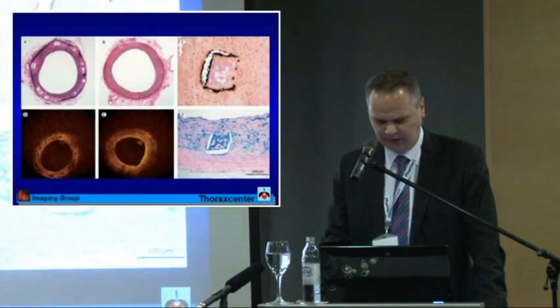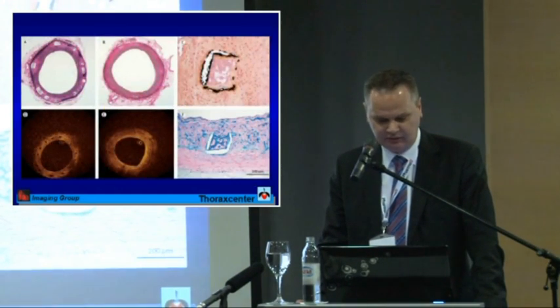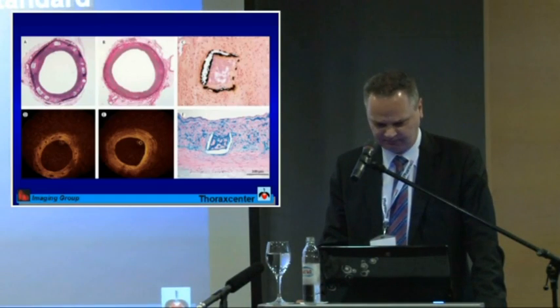And if you look at an implanted stent, you can see here a histology section of a bioabsorbable stent. This patient has come back after 6 months, and you can see that 6 months later it is nicely covered. And at 2 years the stent has almost disappeared, and you can see that the optical coherence tomography images almost have the same resolution as histology sections.